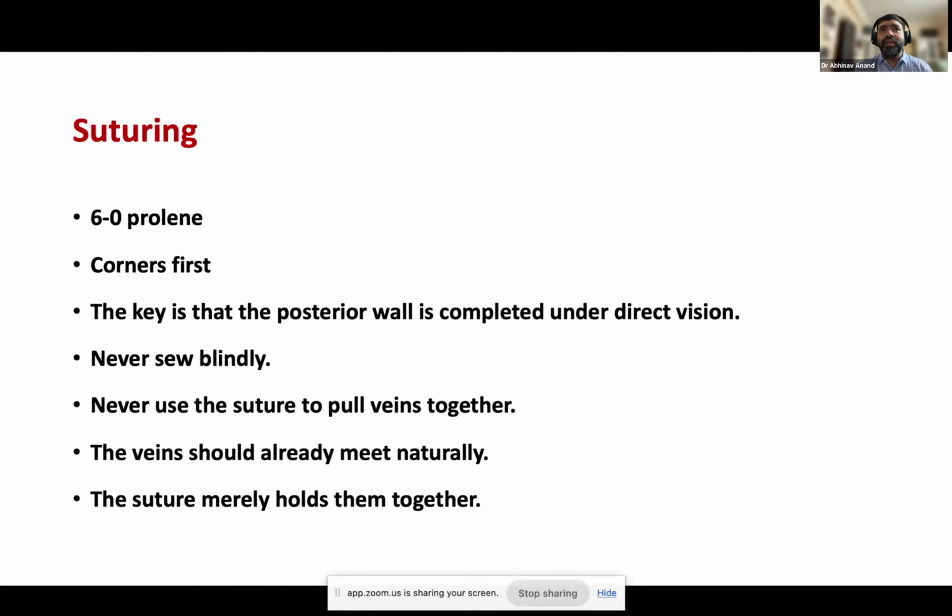So if the plaque is along the entire length of the splenic vein, then we have to be careful and do the anastomosis with that area only. Or if it is from the tip, or if we could get above it with adequate length and the splenic vein is still reaching the renal vein without tension, it can be divided or trimmed off.